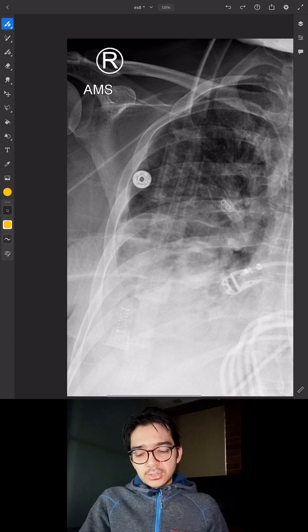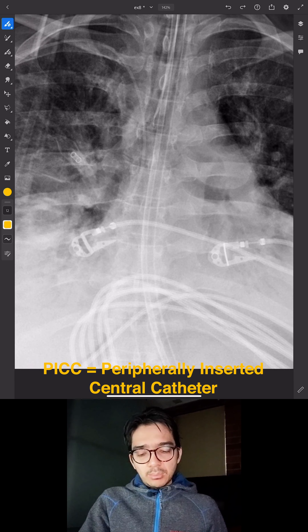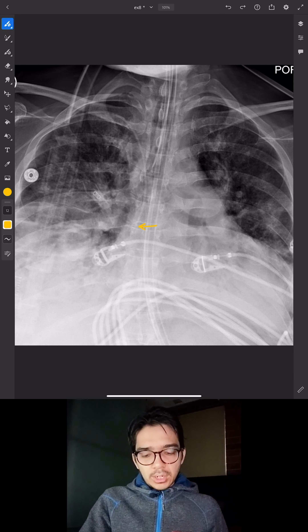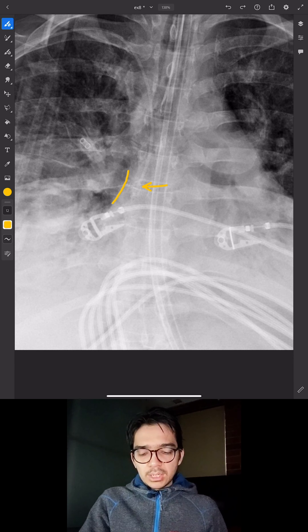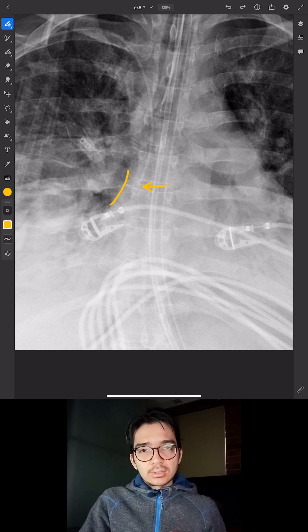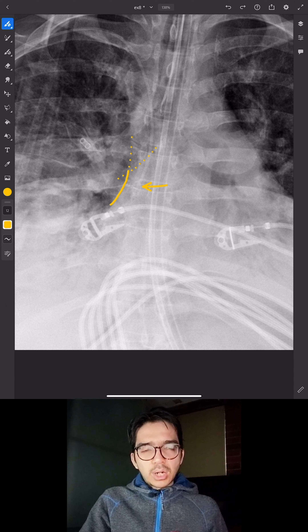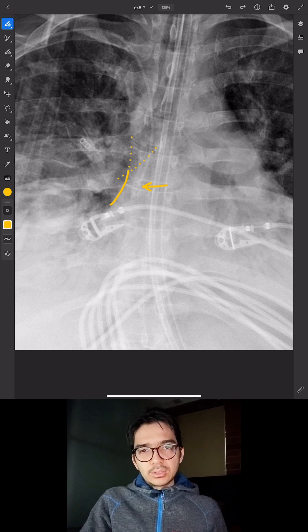Here we can see a central line coming in from the arm, so we know this is a right PICC. The tip of the catheter is right here. You can see a slight inflection point in the right side of the mediastinum, which is approximately where the superior cavoatrial junction is, so I would say this is in good position. The bottom of the bronchus intermedius intersecting the mediastinum also confirms the cavoatrial junction location — two landmarks confirming good position.